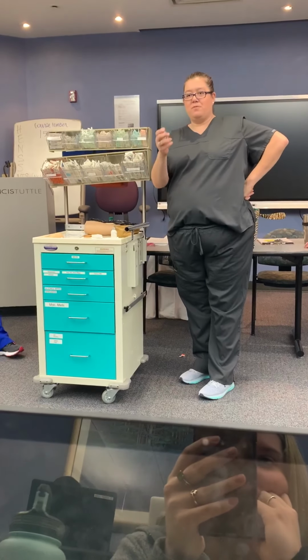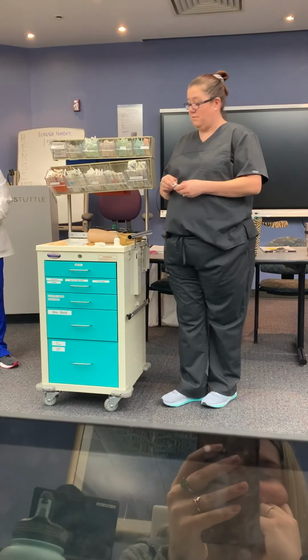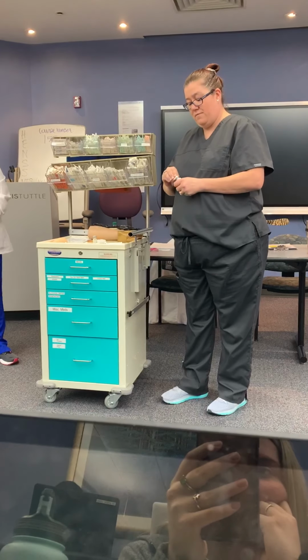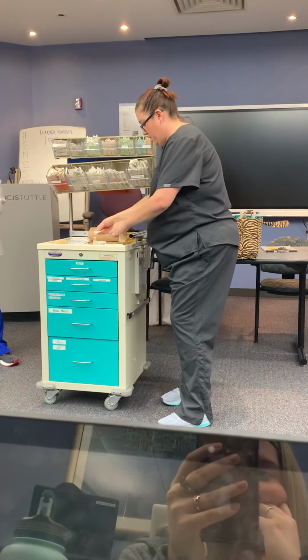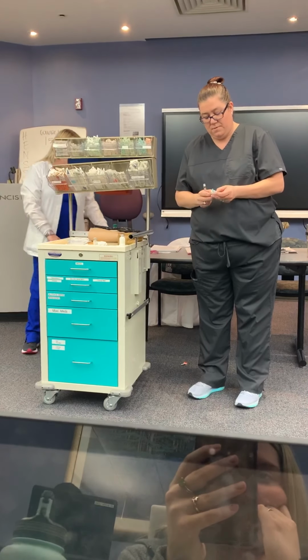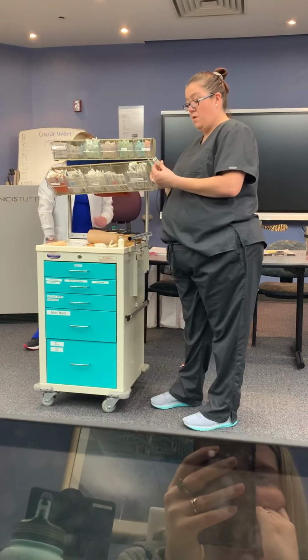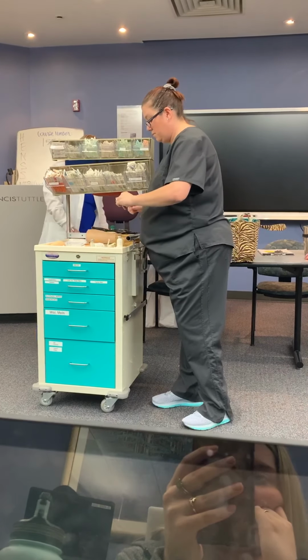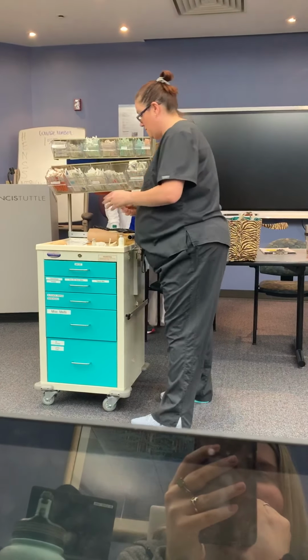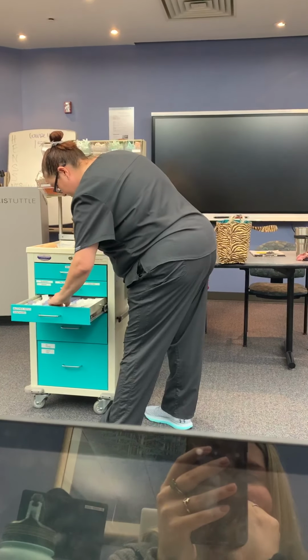All right, so pop that top. Make sure that you cleanse for how long? 15 seconds. I'm also going to cleanse the top of my multi-dose vial. Okay. I'm going to put a needle onto my syringe. And how much did we say reconstitute we were going to use? 3.6. So, I'm actually going to use a different syringe.